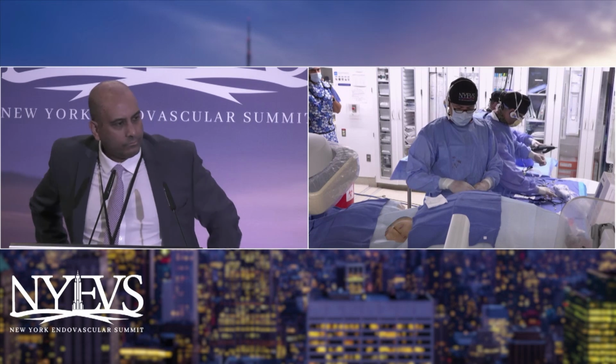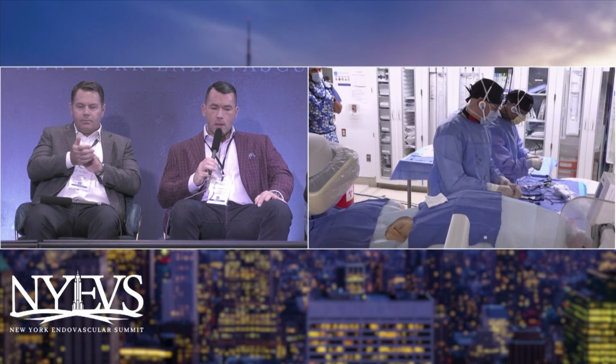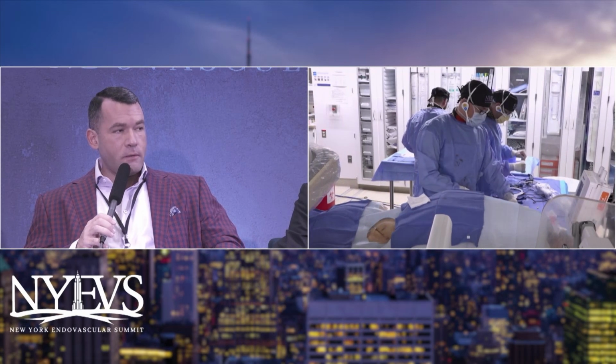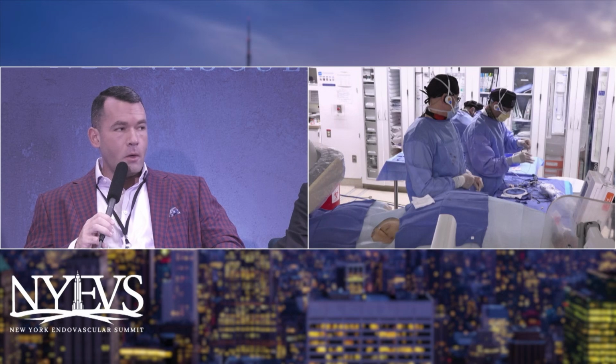So I think a big part of it has to be, what have you achieved? Do you get to a safety point? And then looking at, especially in this patient who's a chronic renal patient, how much dye have they had? How long have you been in the lab for, to determine whether or not to proceed and try to open up another artery or to stop where you are?